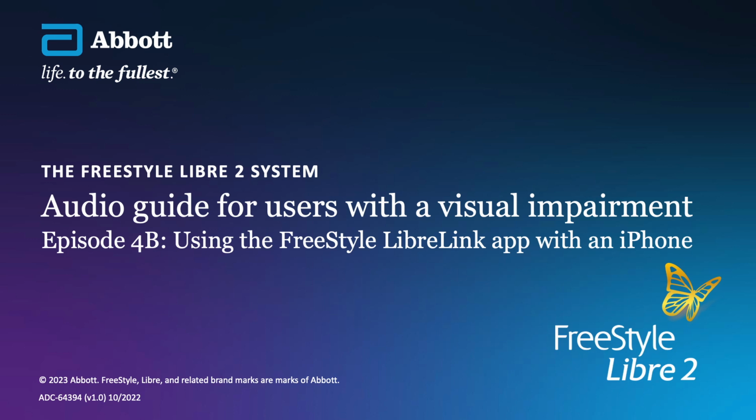The next item on the menu is Order Sensors. This will take you to the FreeStyle Libre website, where you can order more sensors if you self-fund. Connected apps. This allows you to connect your FreeStyle LibreLink with healthcare professionals and/or family, friends or other caregivers. The use of this is detailed in another resource. Reminders. This will allow you to set reminders to scan the sensor or any other reminders you find helpful.